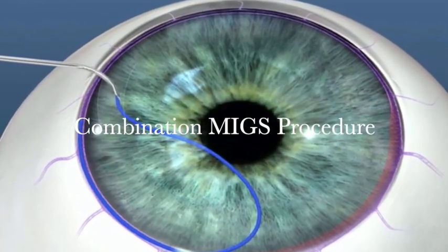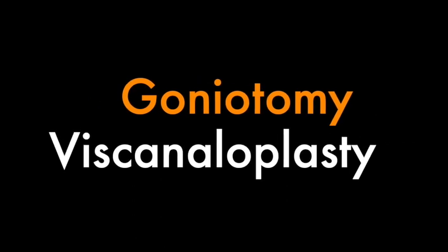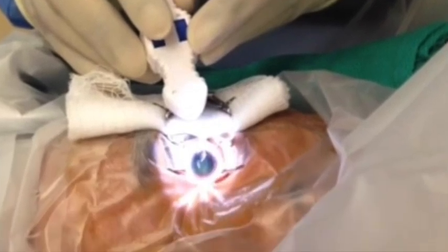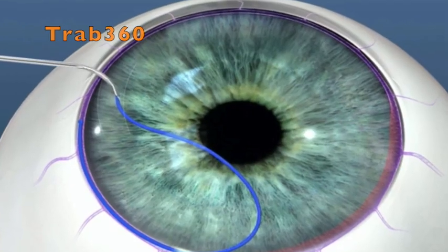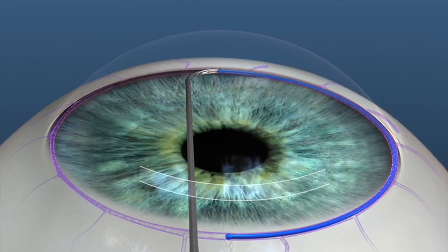This system is unique in that it offers two angle procedures in one device: goniotomy and transluminal viscoelastic delivery. The system is a combination of two prior products from Sight Sciences, the TRAB-360 and VISCO-360, that were originally released in 2015.